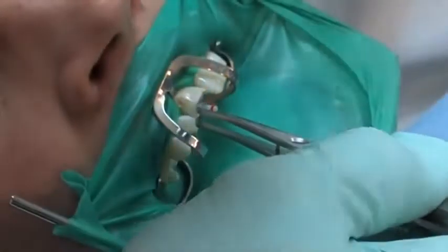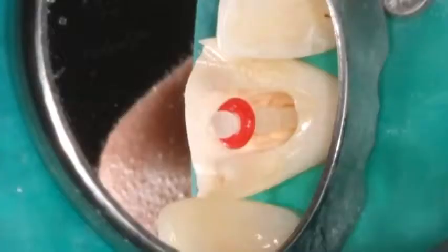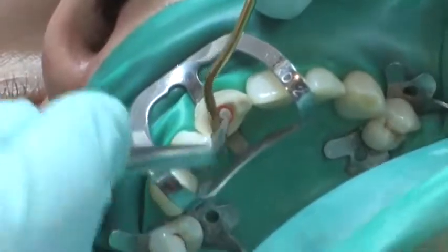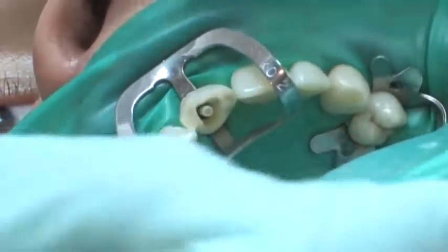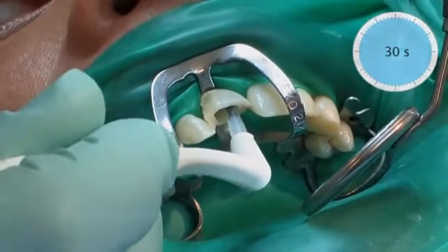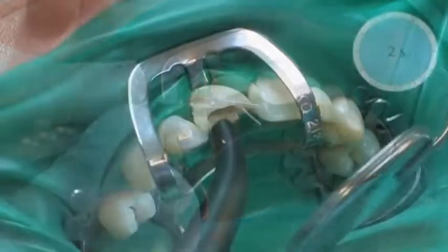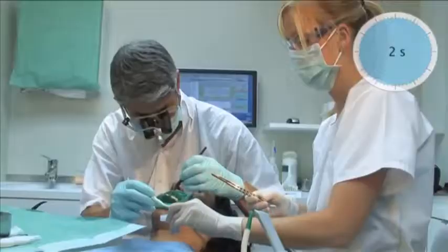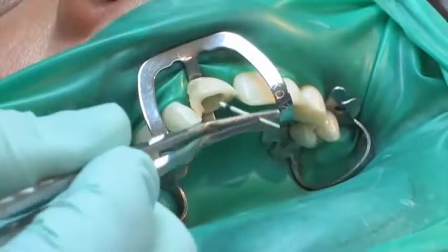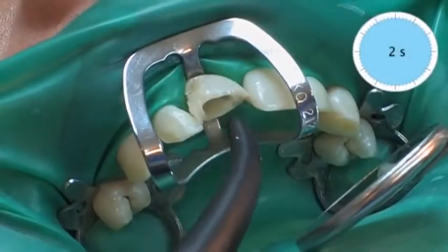The corresponding light-transmitting glass fiber reinforced ParaPost fiber lux post is trial-seated and inspected for proper fit inside the root canal. The post length can be shortened as needed based on the clinical situation. Parabond non-rinse conditioner is massaged into the root canal and onto the tooth surface. Excess conditioner is removed using a paper point and dried afterwards using a gentle stream of air. The mixed Parabond adhesive is applied directly into the root canal and onto the tooth structure. Excess adhesive is removed using a paper point and carefully dried afterwards using a gentle stream of air.